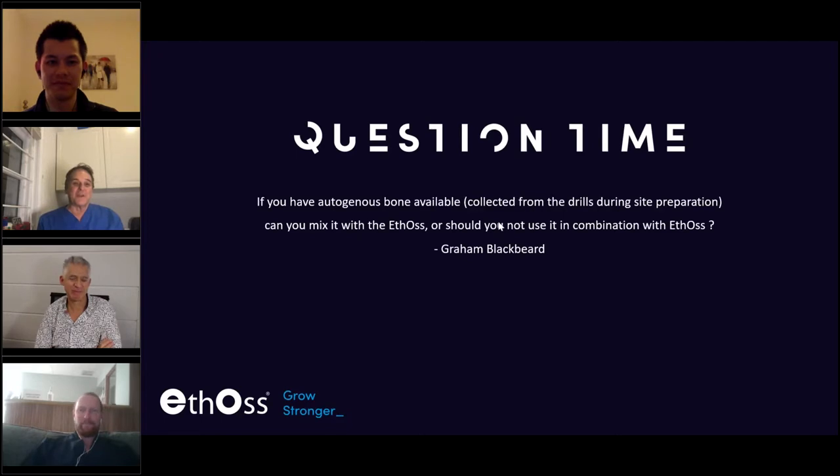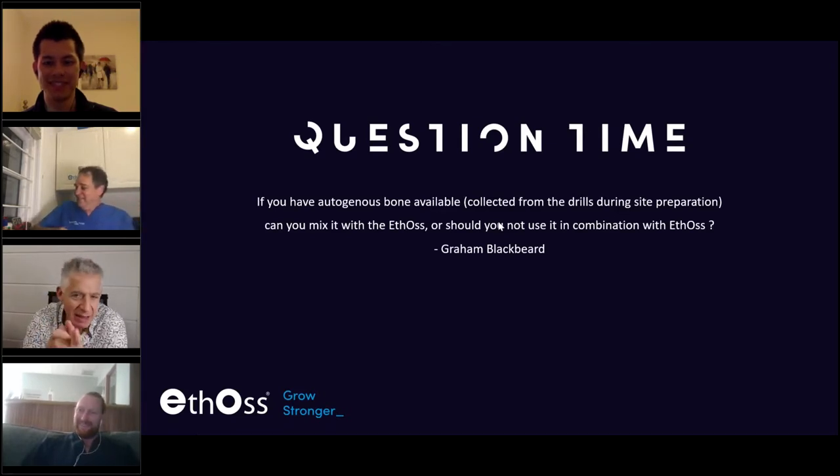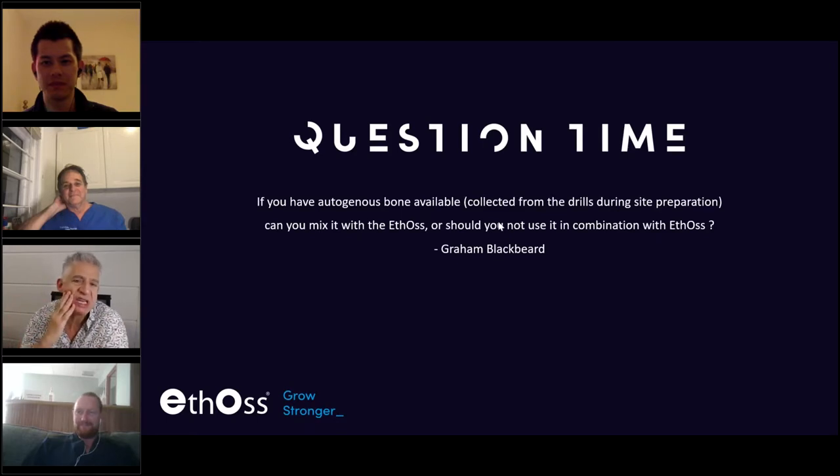Anyway, do you guys want to make a comment, Johnny or Ludwig, on that, or should we move on to the next? But Costa, are you not afraid of pressure necrosis? No, definitely not. Again, Paolo Trisi did the best study where he used a large animal model, sheep, 110 Newton centimeters on one side of the mandible, 10 Newton centimeters on the other side, on the same mandible. Histologically, no bone necrosis in either of the two groups. Even in dense cortical bone, because people are scared. In trabecular bone, you can get away with it, but in dense cortical bone, you'll get bone necrosis. Paolo Trisi showed no bone necrosis.